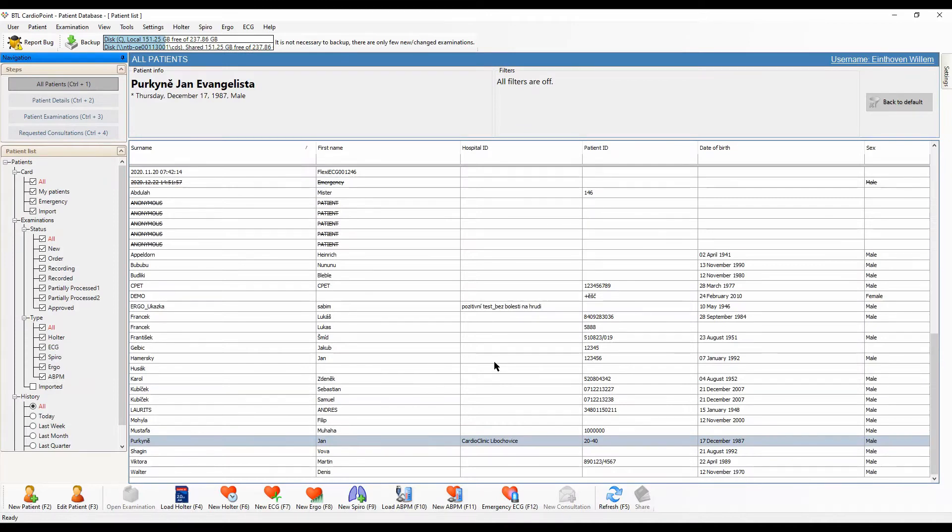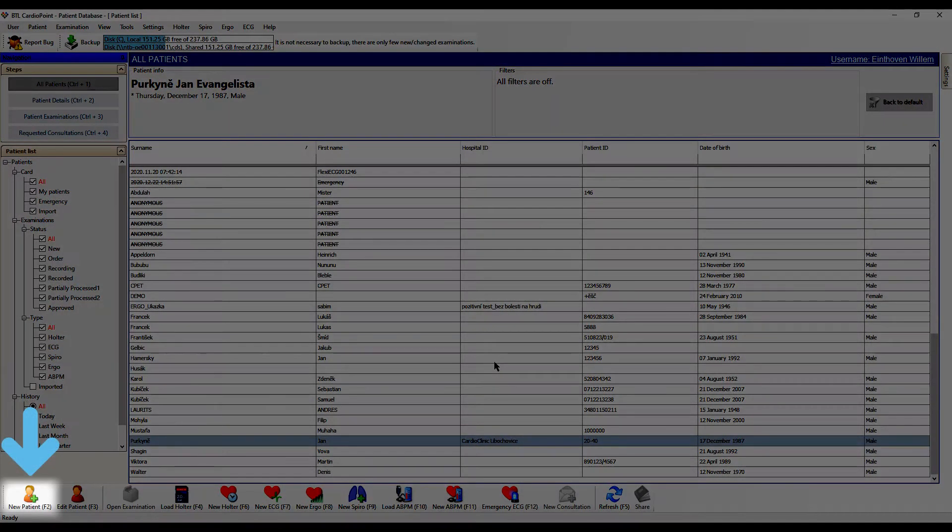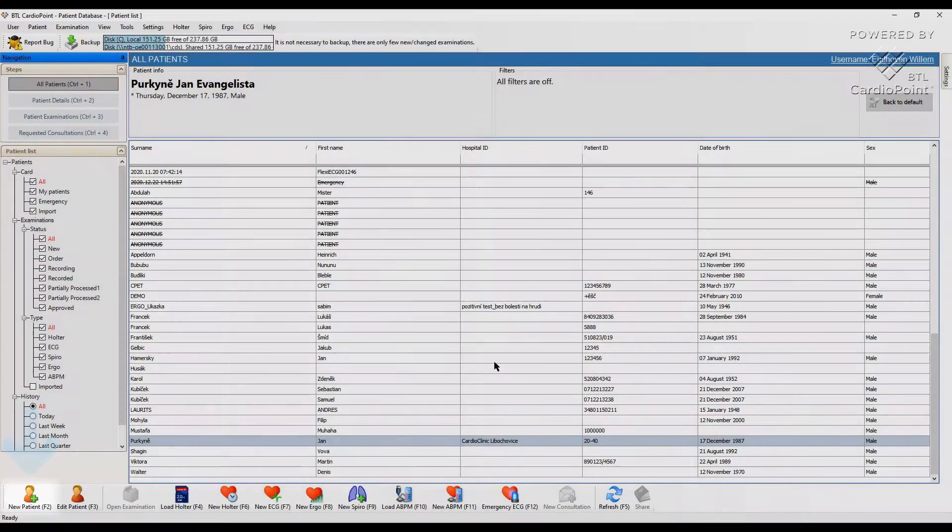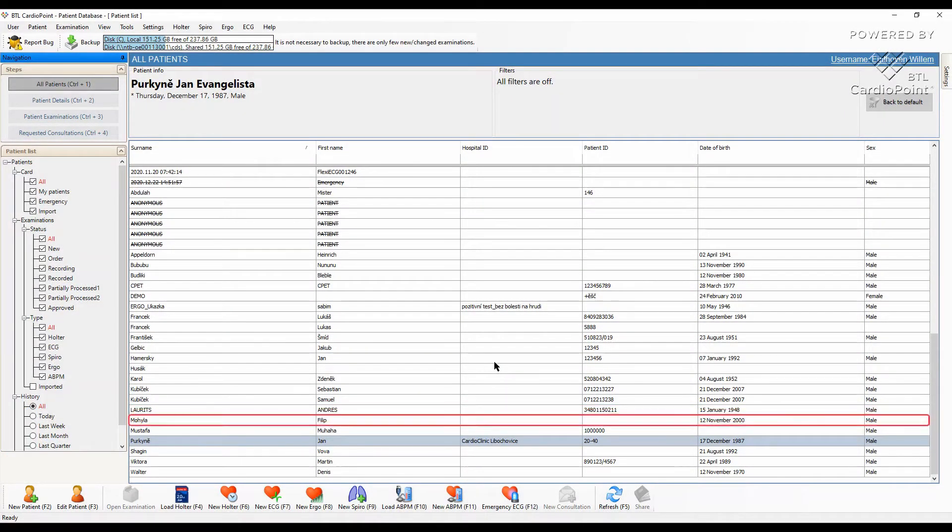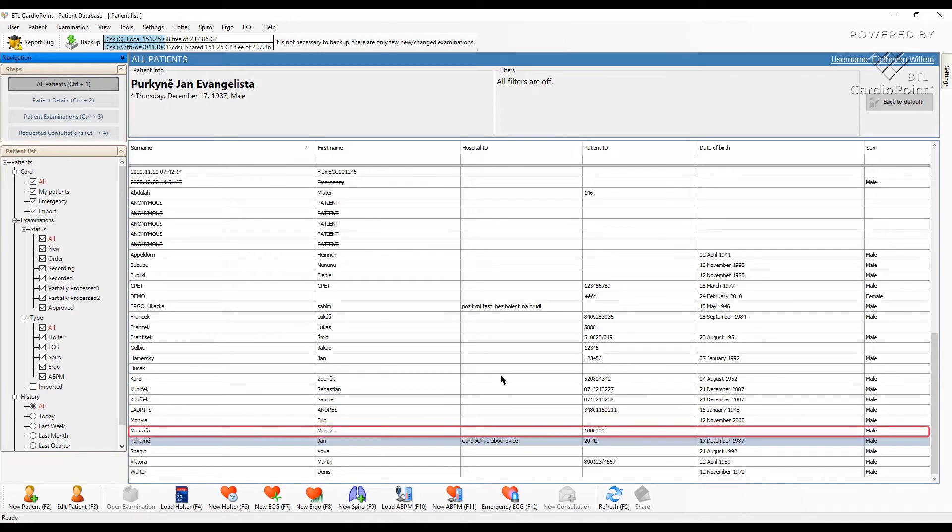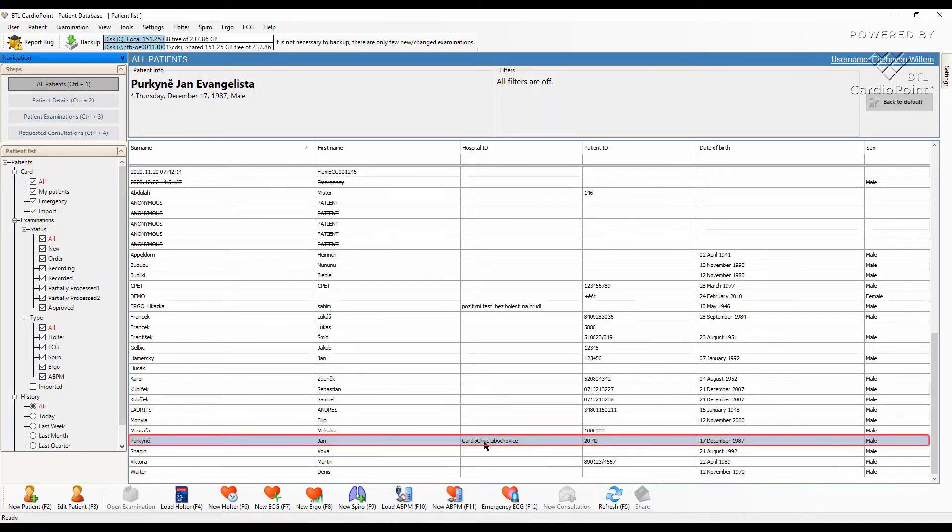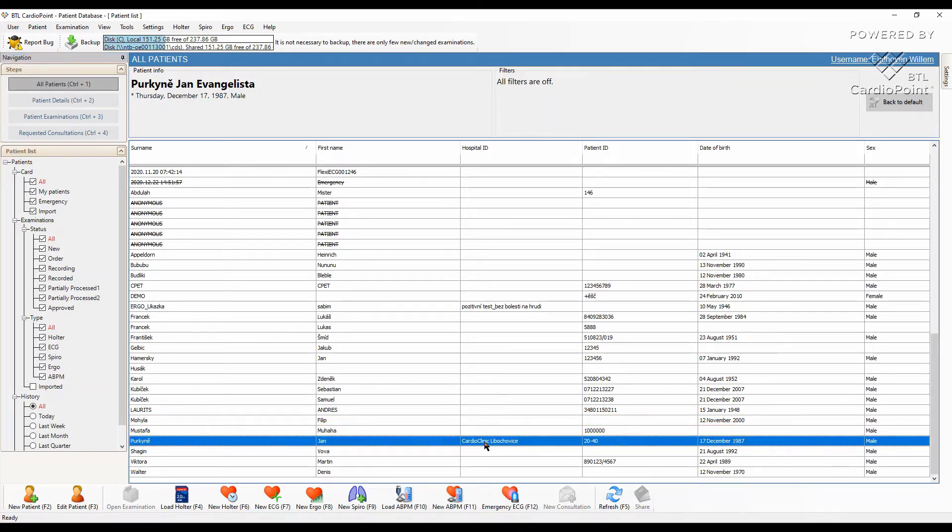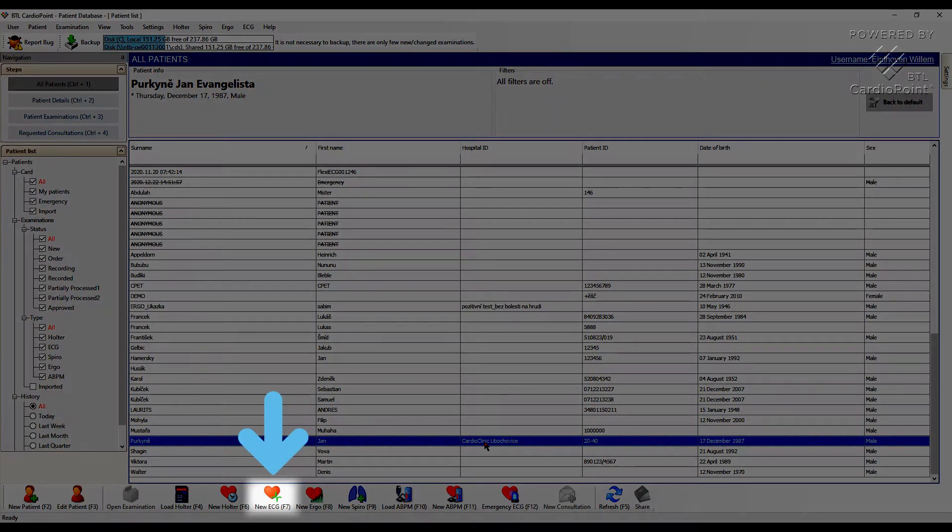In the main window of the program, we need to create a new patient or select an already existing one from the list. Click on the new ECG icon.